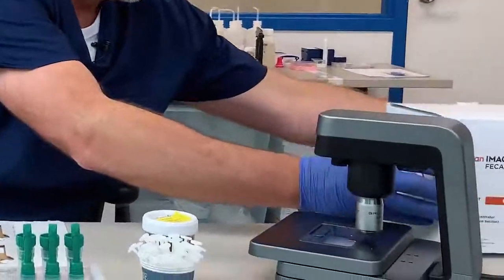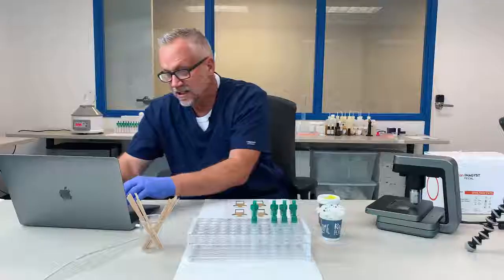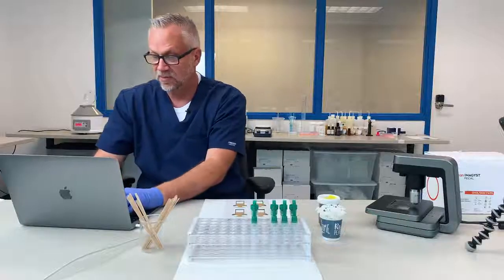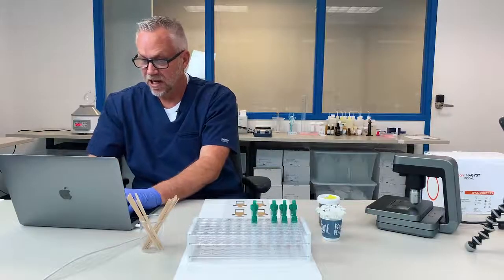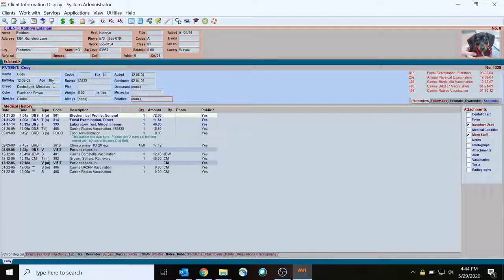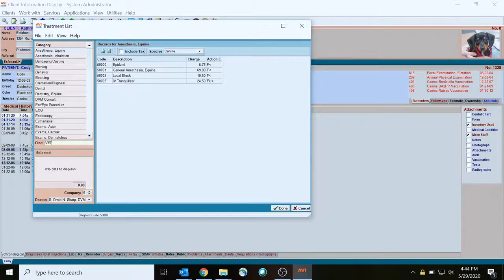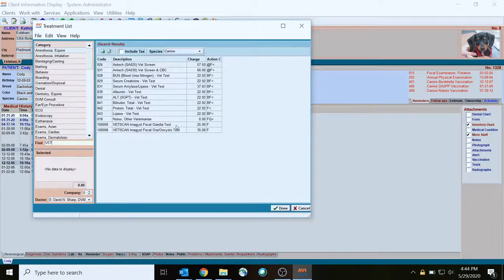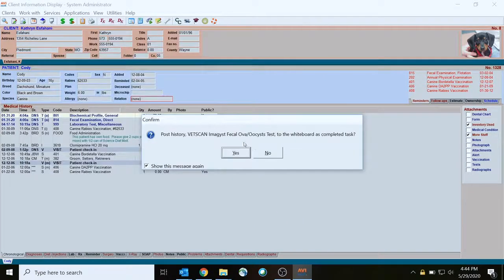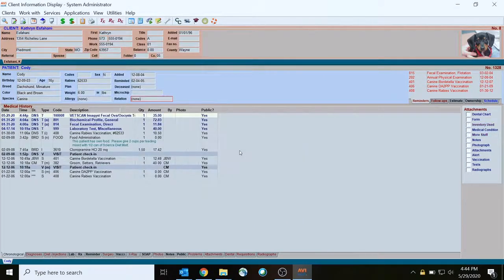Next, we're going to move over to our practice information management software, and we're going to locate the animal's chart and medical record for who we're going to run the test. In this case, we're going to enter the treatment code for a fecal ova and cysts test for Cody, a dog with a patient ID of 1328.